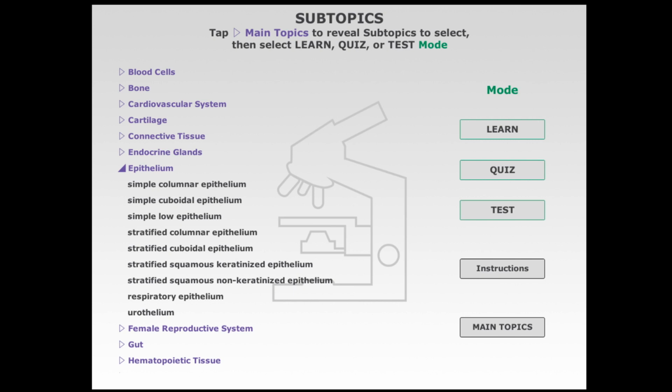The Quiz mode is similar, but presents slides in a randomized order and hides the answers and explanations by default. The Test mode asks you to type in answers and to grade them. Students typically use this before an exam to see how well prepared they really are.